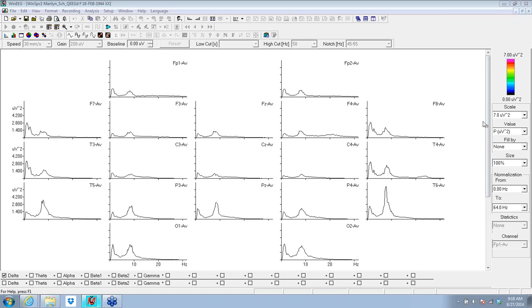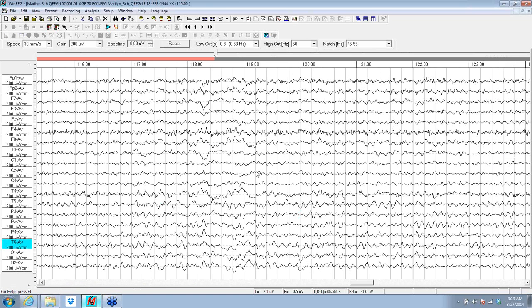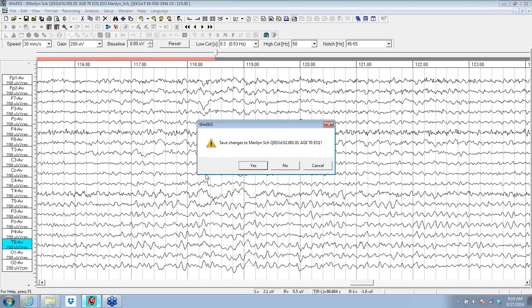So in this case, we basically have, in the eyes open, an indication of cerebrovascular insufficiency with temporal slow alpha. That's probably related to ischemia. The American Academy of Neurology approved QEEG as a way to assist in assessing vascular issues in the EEG. Above and beyond the EEG, the QEEG provides value according to the American Academy of Neurology. And their very current position papers show that essentially the slowing of alpha can correspond with ischemic change in the brain. So we're probably looking at a vascular change here, potentially vascular dementia, given how slow some of the content is. Now, we've only looked at the eyes open.